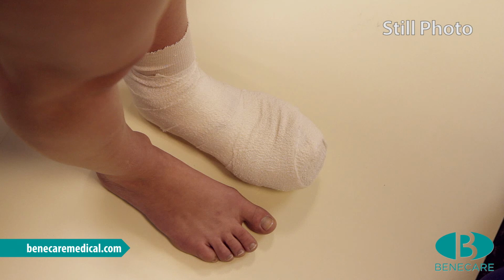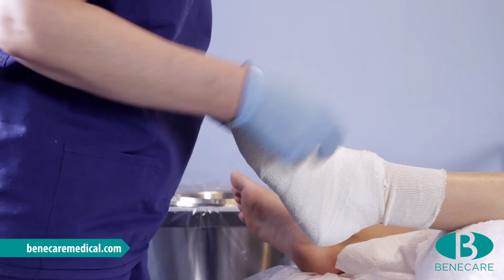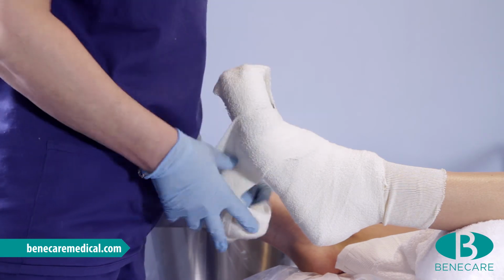The patient will need to stand for approximately 30 seconds to 1 minute. During this process, the patient should be stood upright, not trying to look at what I'm doing on the floor. Position the patient back on the bed. I will now remove the wet bandage.